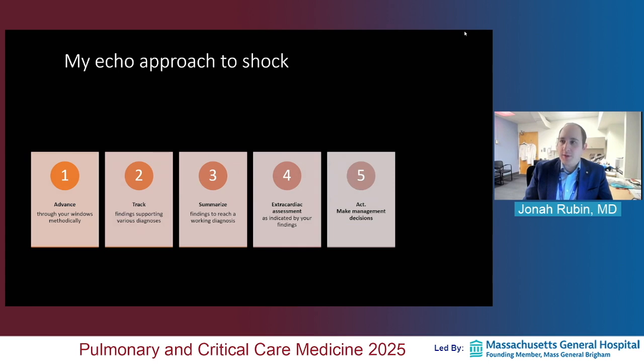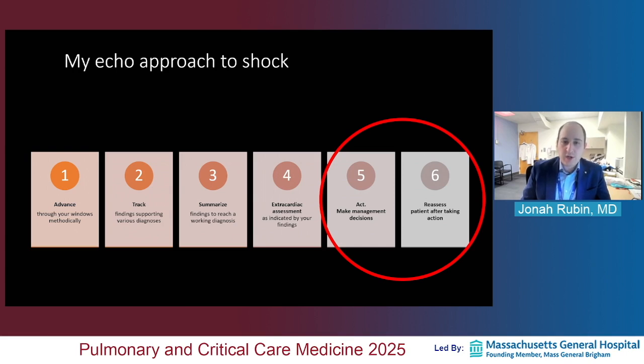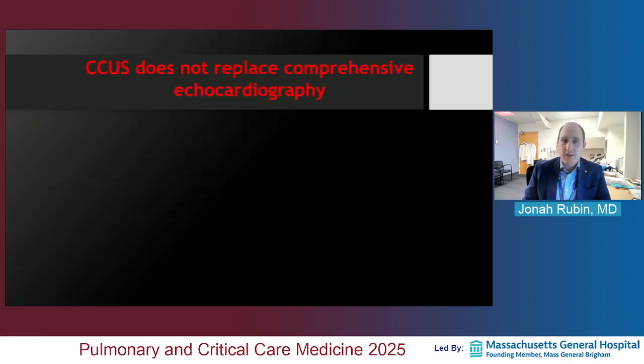You make a management decision. You do something about what you found, and then you reassess the patient after you're taking action. And these final 2 steps, to me, are the most important in distinguishing critical care or bedside or POCUS ultrasound from comprehensive ultrasound. Because critical care ultrasound certainly does not replace comprehensive echocardiography.